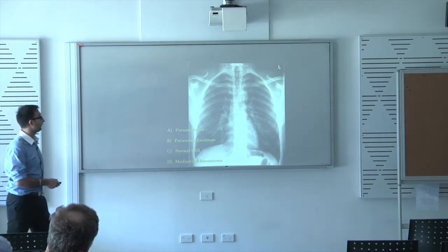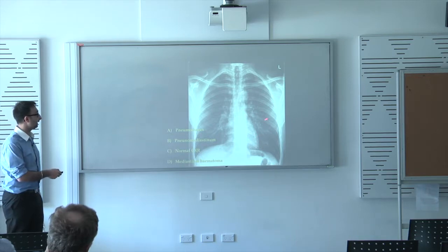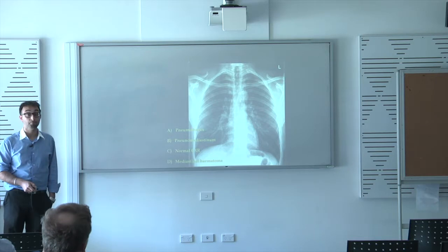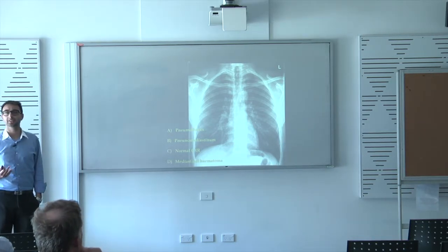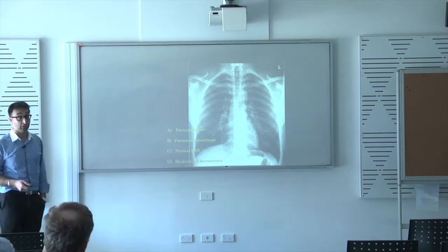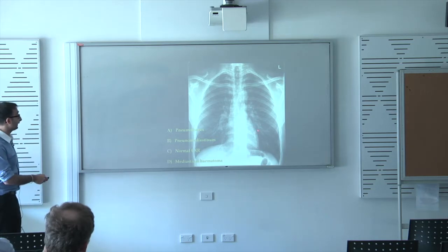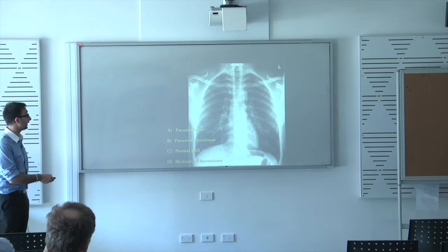I don't know if you can see it very well, but these can be pretty sneaky, and there's a little linear lucency that runs along the heart here. That's basically air that's outlining the mediastinum. So sometimes you'll look at the heart border and think, that just doesn't look right, it's too lucent. What you need to look for is this air lifting into the mediastinum, which gives you this linear density. And if it's a pneumopericardium, you look for a bit of gas which lifts the parietal pericardium, and you see a density down here.